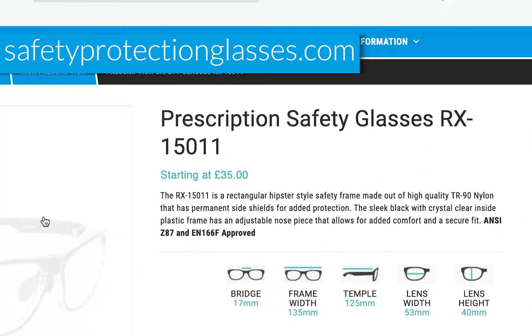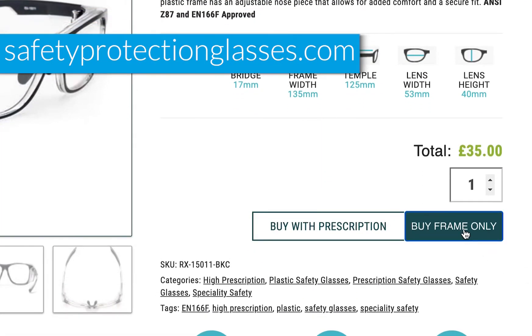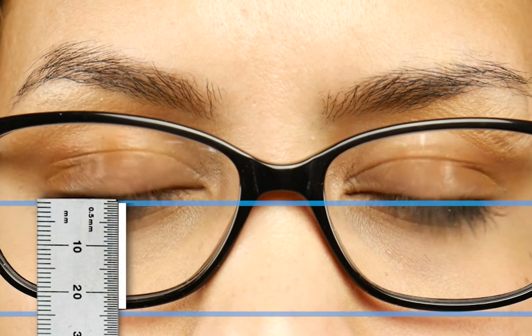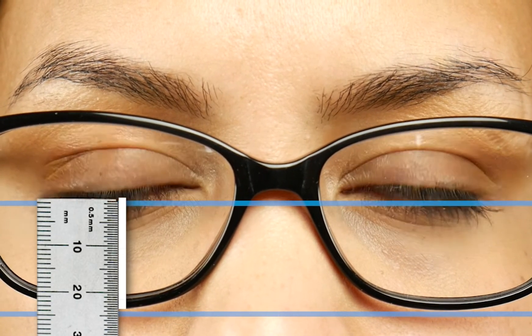If you're wanting to measure this yourself, all you need is the frames. If you've gone on our website and chosen a frame, you can pick the option to select the frame only. Once you've gotten the frame, put them on however they sit comfortably, and then you can ask someone to help you take the measurements. Using a millimeter ruler, measure from the bottom of the lens to the top of your bottom eyelid, and make sure to look straight ahead.